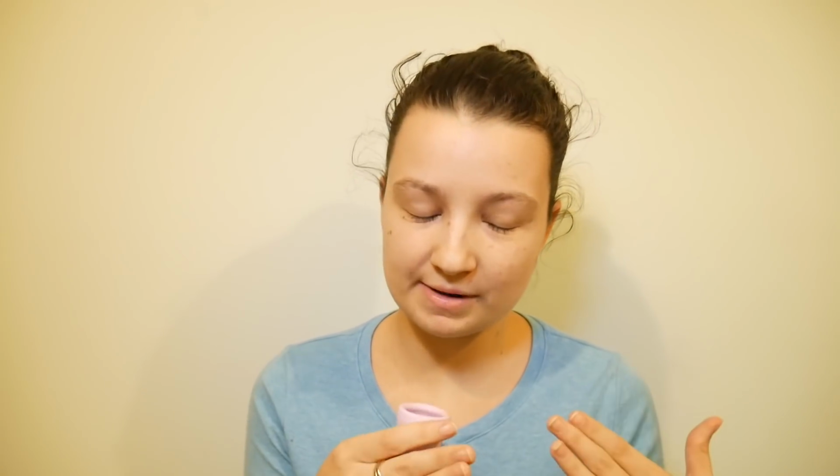Well, first of all, I want to say one of the big benefits of using TPE over silicone is that TPE is fully recyclable. So silicone is very difficult to recycle. In fact, they don't really know what to do with it yet. They're still experimenting with it. Whereas TPE, they know that they can recycle. So if you're someone who's very eco-conscious, this is definitely going to be a good cup for you to consider. The only downside to using TPE is that it's going to only last around 5 years rather than the usual 10 that a silicone cup would. So do also bear that in mind.